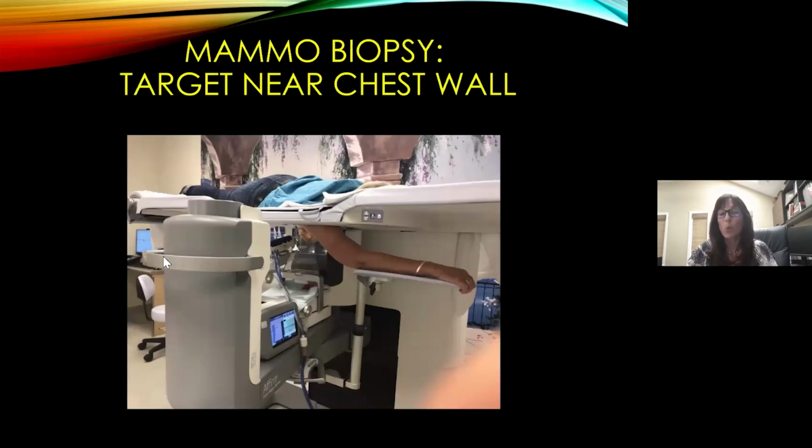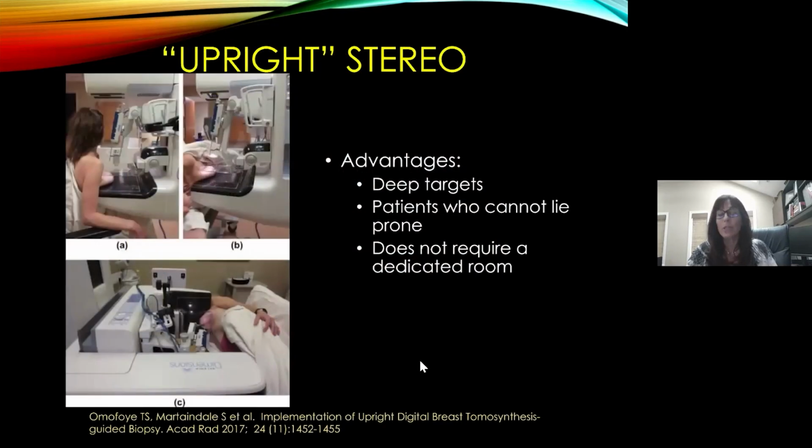Well, one option is to bring the arm through the hole and rest the arm on a device that's attached to the table. And you can get a little bit deeper with this because the whole chest is going a little bit lower, so you can access a deeper target. An upright unit, though, is actually easier to obtain a deep target. I do not have this at my institution, but I know that you can get deeper targets because you don't have the thickness of the table in the way.